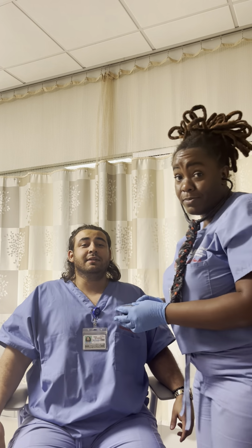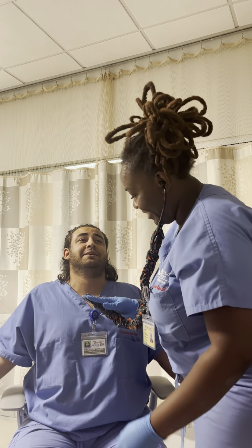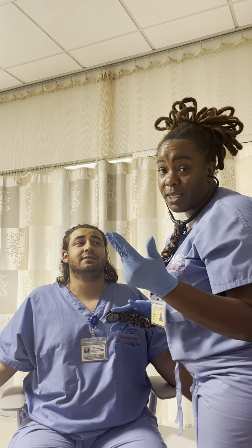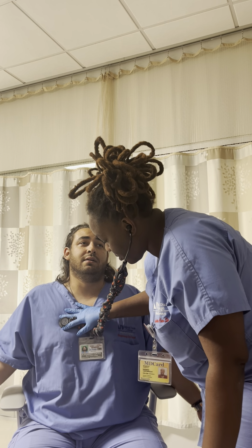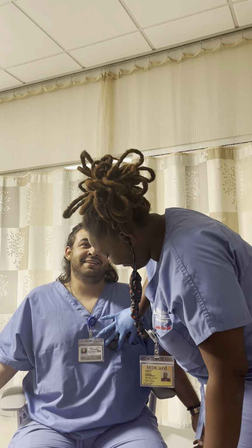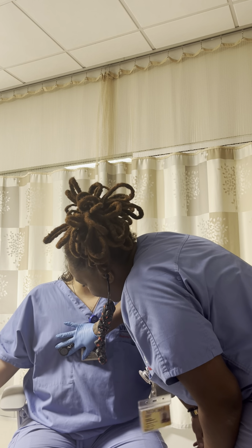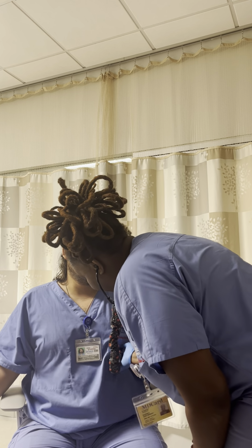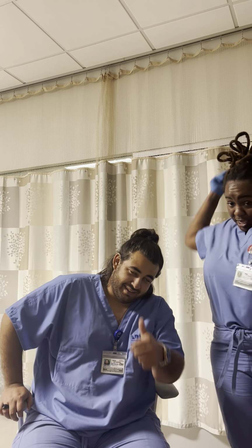We're opening up those lungs. We're opening them up. Okay? Heart rate, SpO2, respiratory rate, temp, blood pressure, and breath sounds, okay? All right, magnificent. We're gonna perform this again one more time.